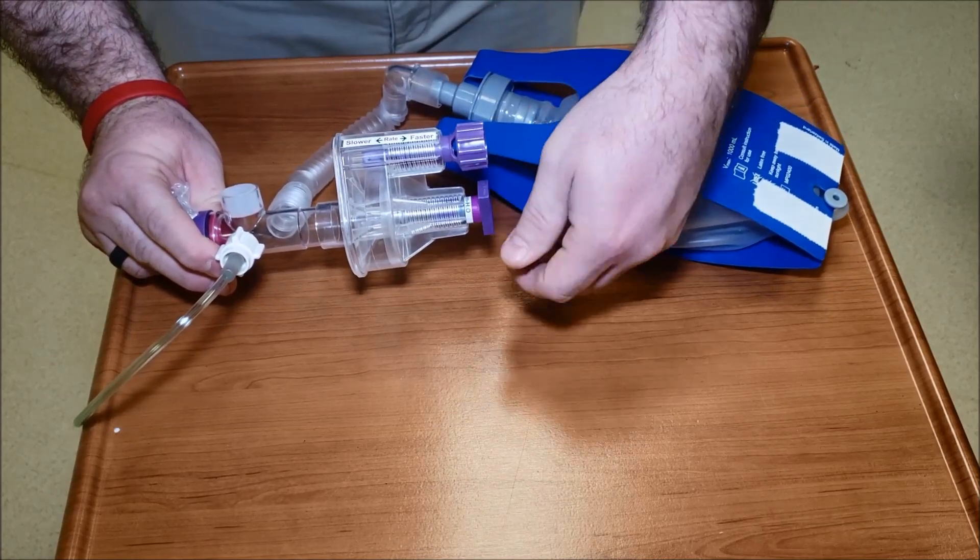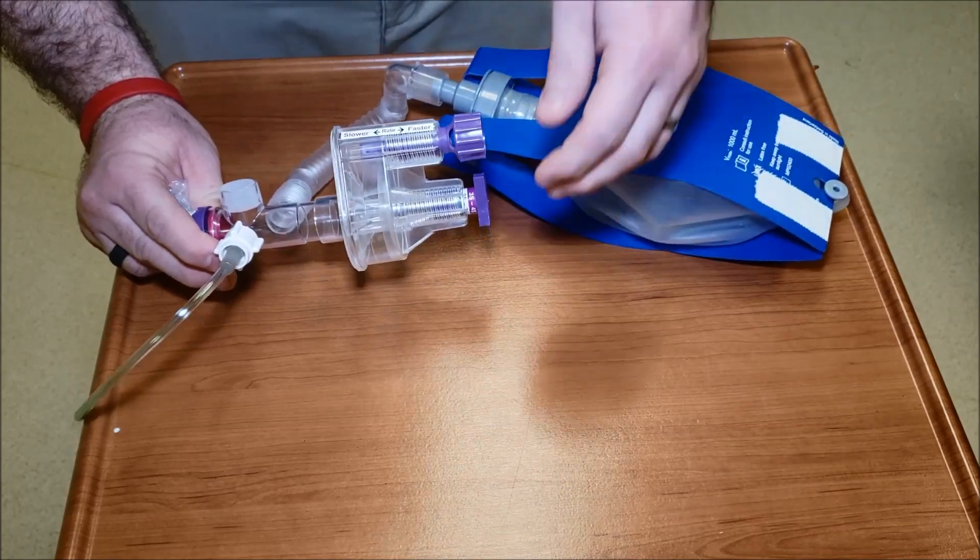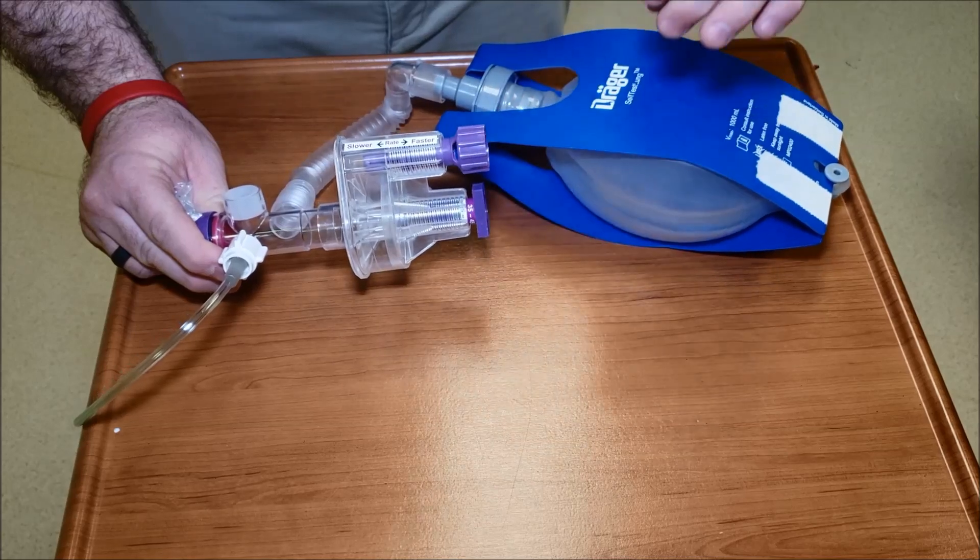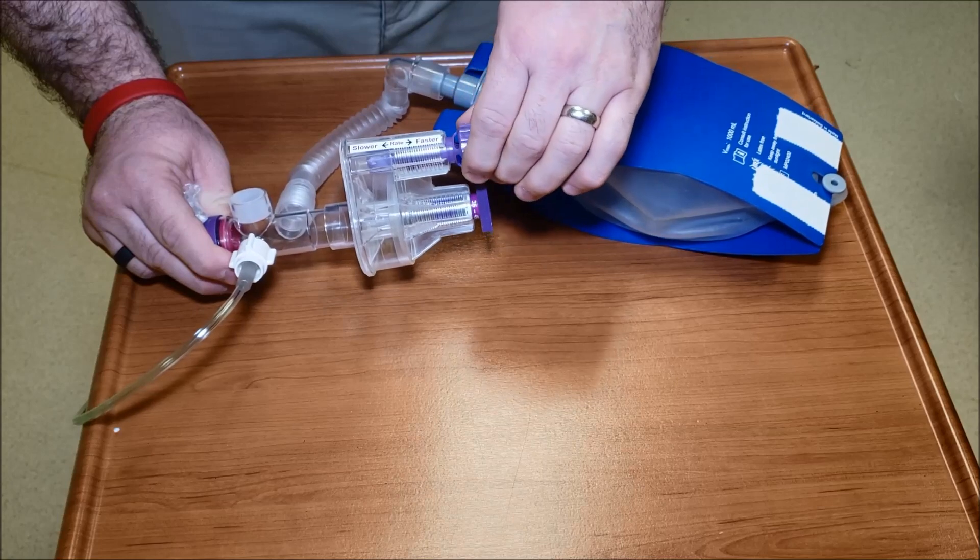Now if you're not getting adequate chest rise, you want to do your usual assessment that you would do, but then you can increase your inspiratory pressure. It's going to take a little bit more pressure work to cycle at that time. You're going to have to readjust your rate just a little bit.